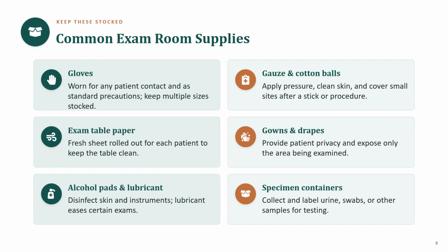Finally, specimen containers are what you use to collect and, just as importantly, label specimens like urine or swabs before they go to the lab. The theme for supplies is anticipation and stocking. The provider should never reach into an empty box, and a well run room has all of these ready before the patient walks in. When you restock, also watch expiration dates and keep clean and dirty areas separate.